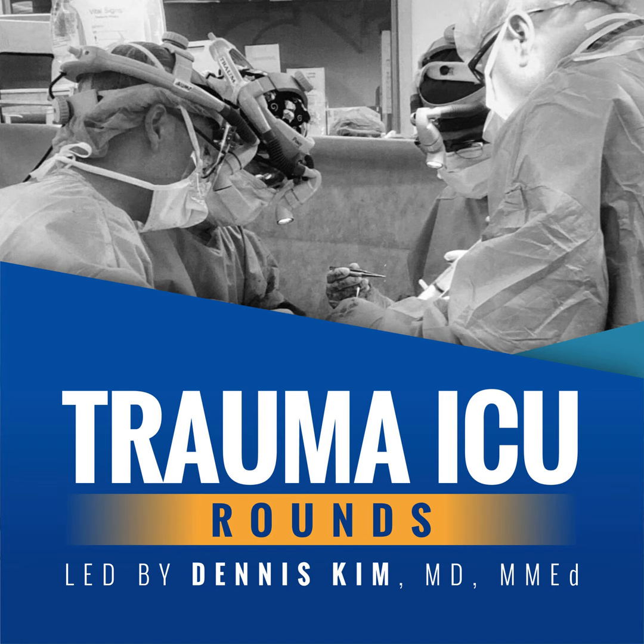The two most commonly used triggers, however, are pressure and flow. So with pressure triggering, the ventilator requires the patient to generate a small negative inspiratory pressure in the ventilator circuit. This is typically somewhere in the range of 1 to 3 centimeters of water, but we can change this pressure if we need to. Once that negative pressure is sensed by the ventilator, the machine changes over to inspiration from expiration to deliver the next breath.